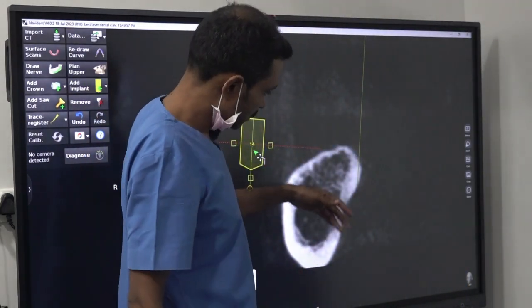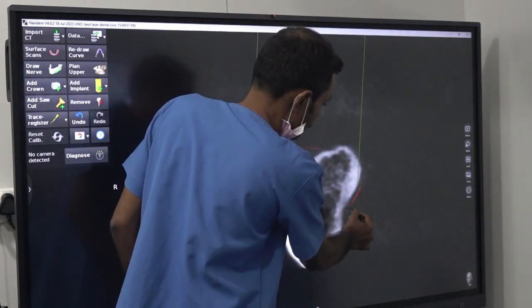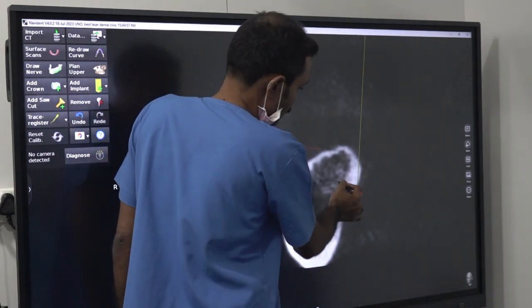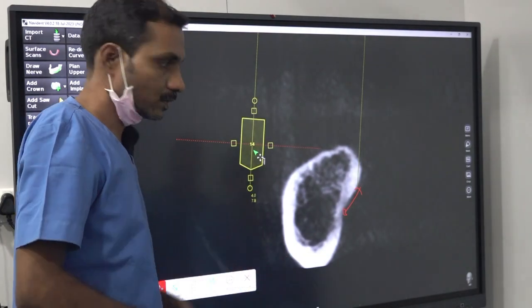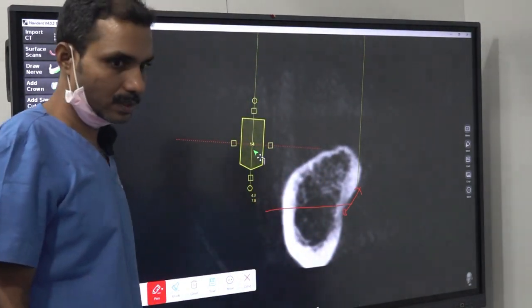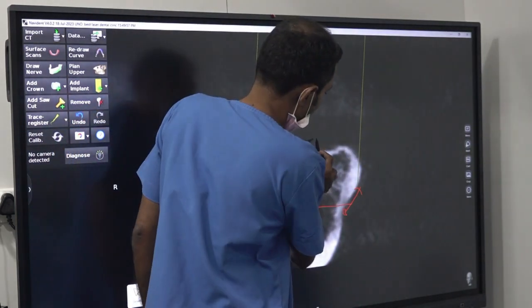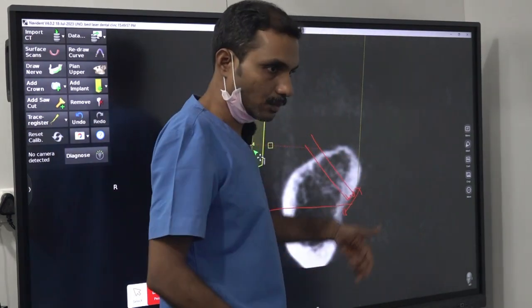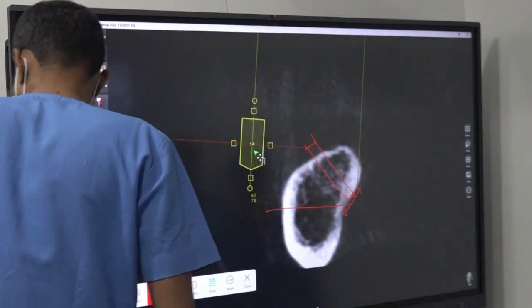If you remember the first molar area, this part is very less. And this bone is also not very proper. And the nerve is also diffuse. But definitely here the nerve will be below this. I don't have to see the CBCT. Even without CBCT we can do this lingual cortical engagement. The only thing is you have to keep your finger and do the drilling, feel the drill upon your finger, measure it and do it. So we will see the length here.